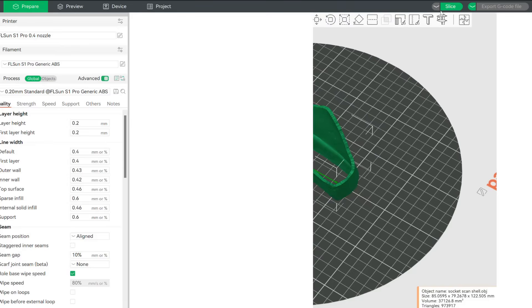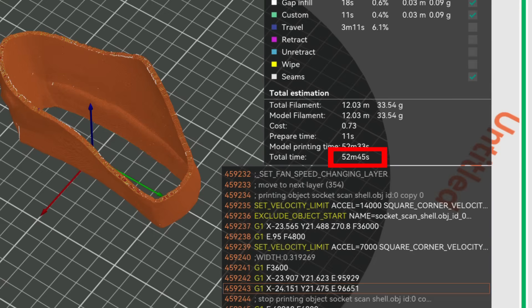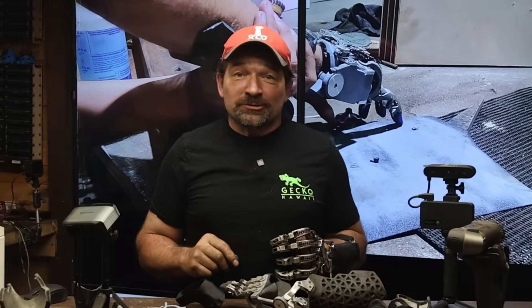I printed the sockets using both the S1 Pro and T1 Pro machines. The reason I chose those printers over my other machines was the print speed. The FL Sun could print one socket in right at an hour, where the Creality K2 Plus would take just shy of three hours for the same print. I ran it on both Delta machines — just in case something went sideways, I'd have at least one socket to work with. Fortunately both prints were successful, giving me an extra one just in case I screwed something up in the trimming.